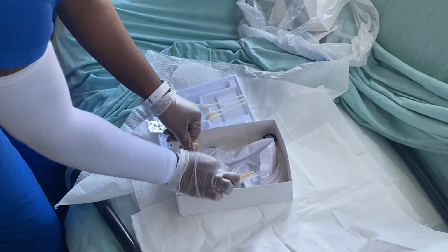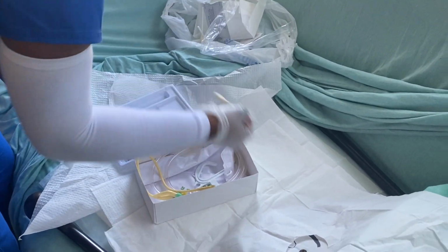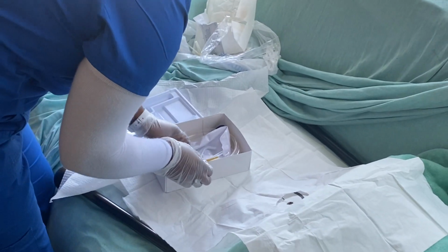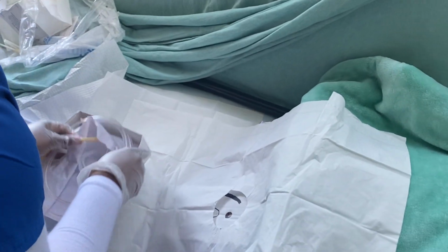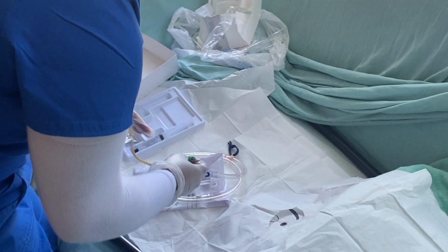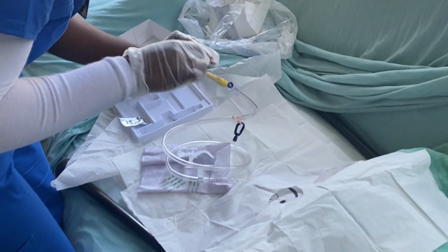Okay. So now I'm going to wipe down your labia from the left side, right side, okay, down the middle. Okay, now take a deep breath for me. Inhale. I'm gonna hold your labia. First, well, before I do that, let me hold this. I'm gonna cap my syringe, my pre-filled syringe.